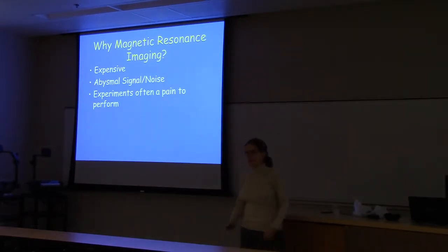So the experiments are pretty hard to perform. For me, I'm working with mice. For you guys, I could ask you to get in the scanner, well, if you could fit and hold still. I still haven't figured out a way to ask my mice to hold still. So for them, we've got to anesthetize them. When you anesthetize a warm-blooded animal, they can't keep themselves warm. So we also need to keep a water heating pad in there.